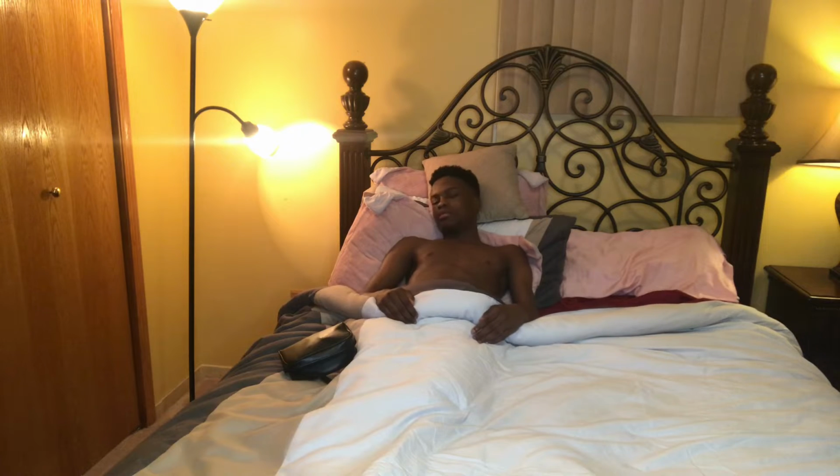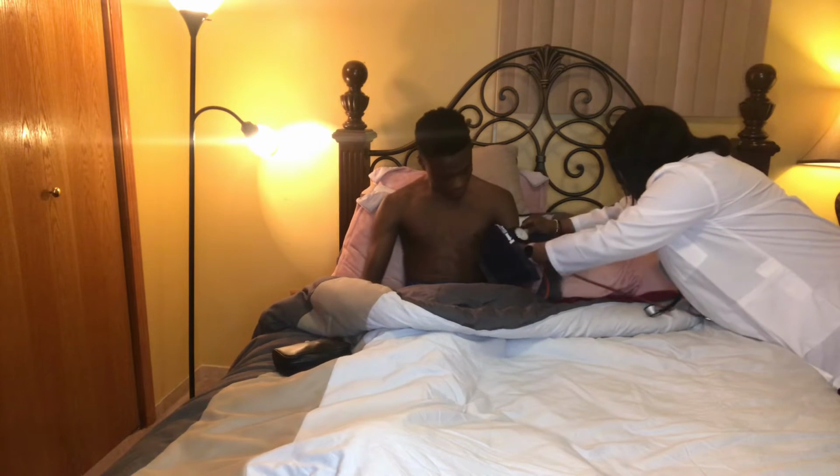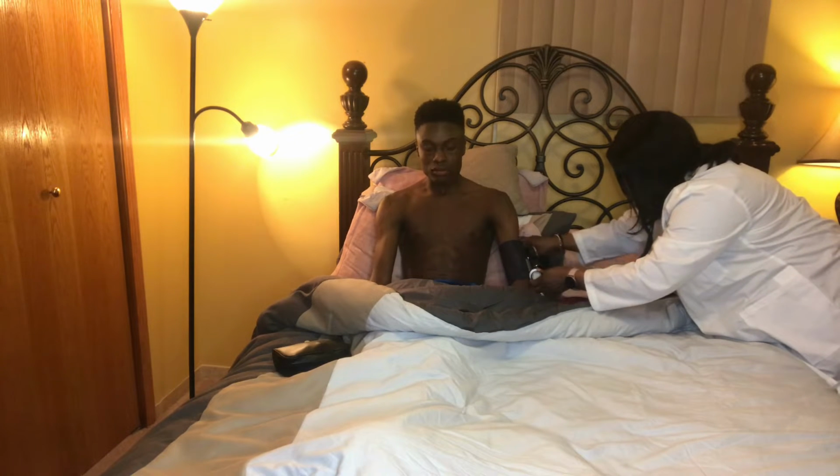Now I want you to sit up. I need you to sit up in bed, sit up straight, so I'll be checking your blood pressure while you are sitting up.